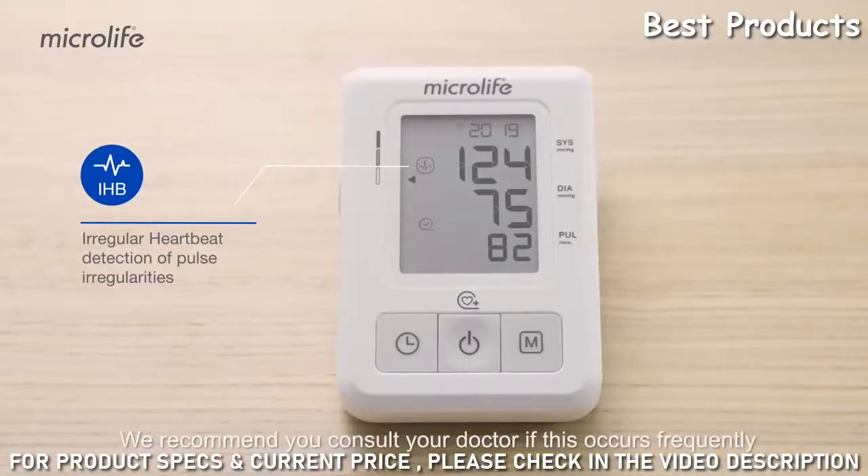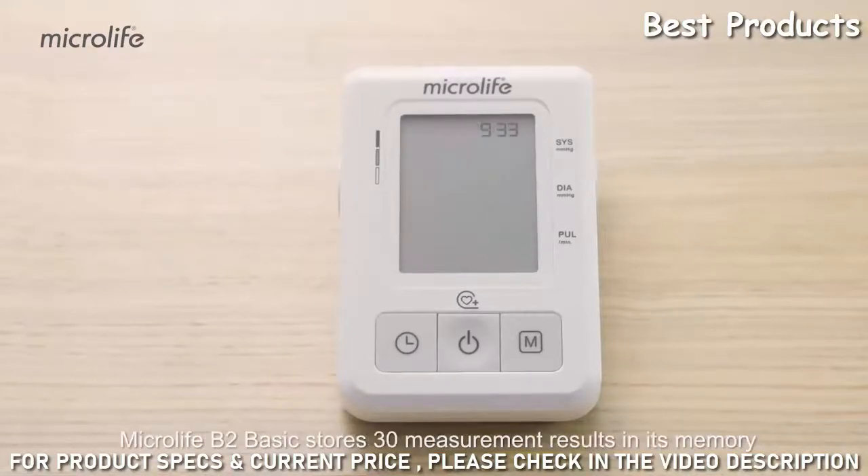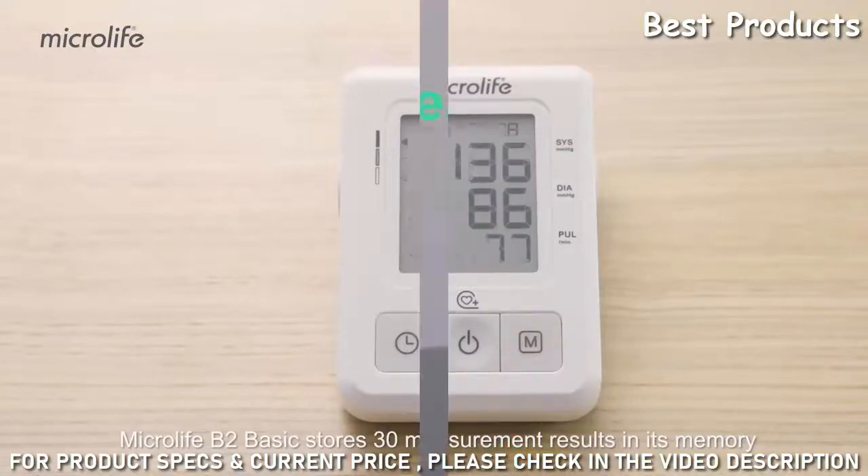The IHB symbol is displayed when irregular heartbeats are detected during the measurement. We recommend you consult your doctor if this occurs frequently. The Microlife B2 Basic stores 30 measurement results.